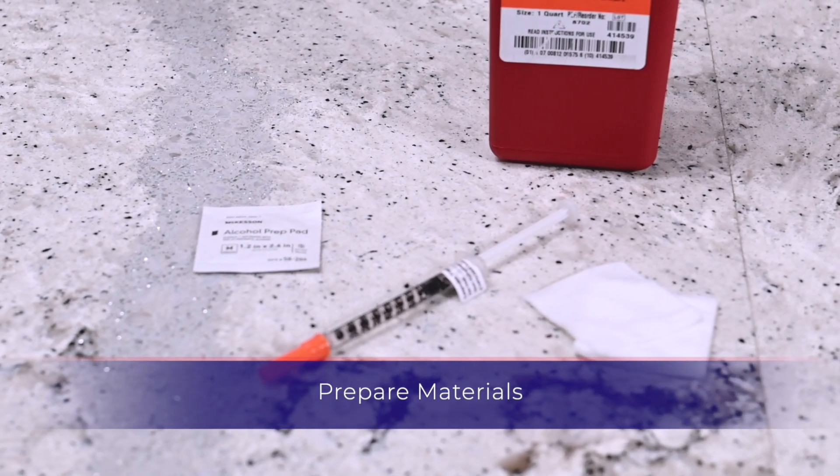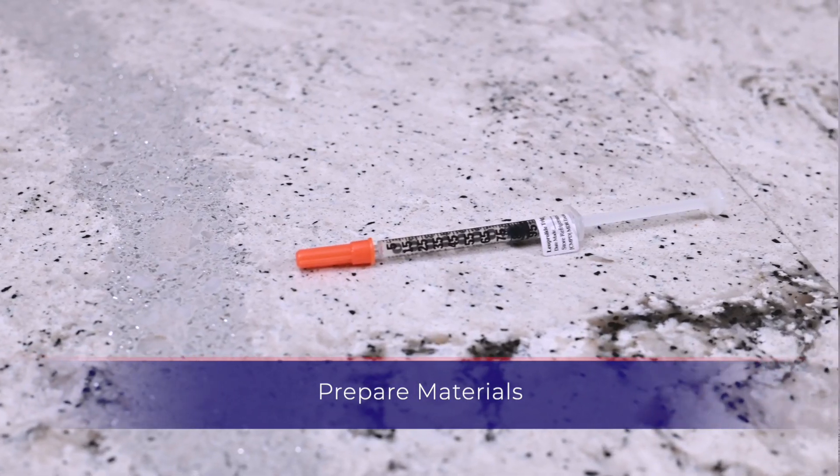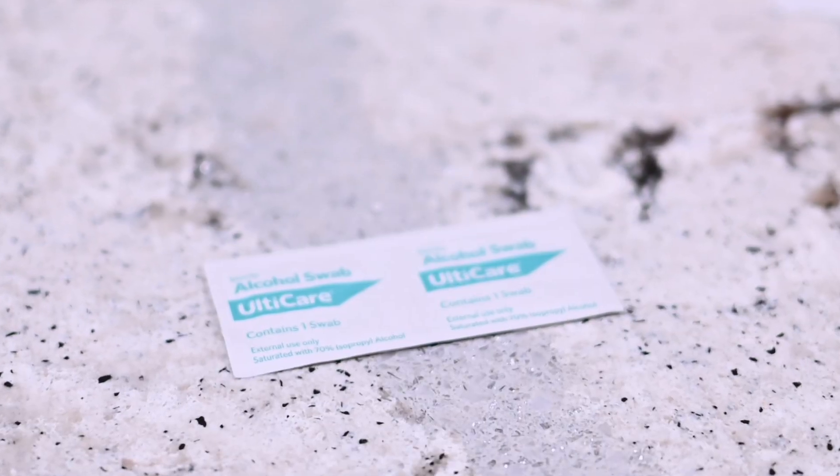First, you will need the following items: a pre-filled Lupron Trigger syringe, gauze, alcohol prep wipe, and a sharps container.